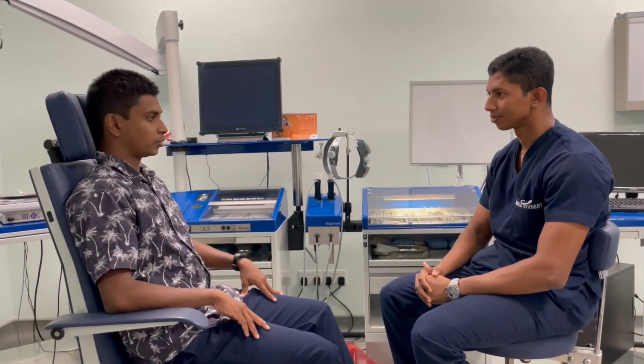Good morning. I'm a fourth year medical student. Today I'm going to do a nasal examination on you. During this examination, I will inspect your nose and then use a medical instrument to look into your nasal cavity. You might feel some discomfort, but if you feel uncomfortable at any given moment, we can stop the examination. Would you like to proceed with the examination? Yes, sir.